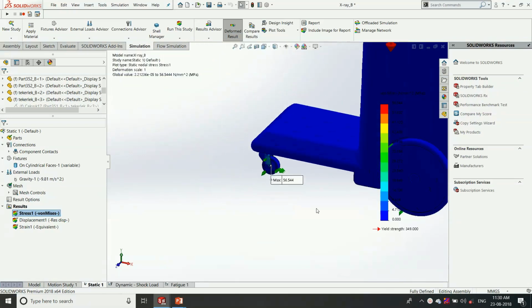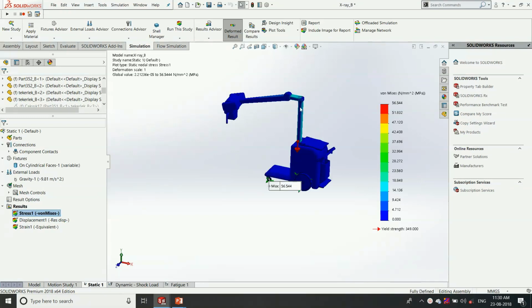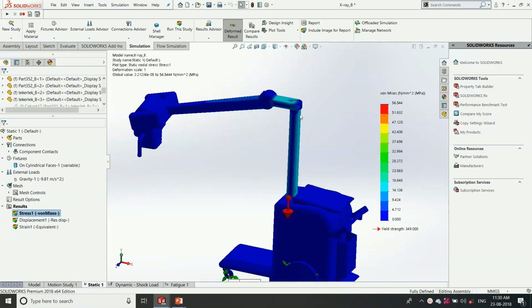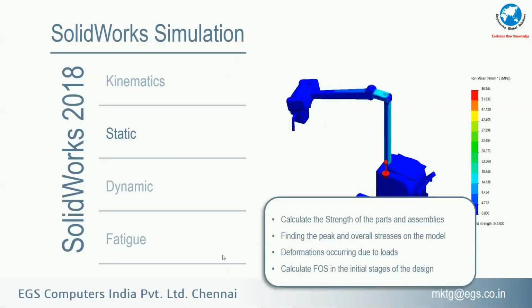So this process will give a clear-cut idea whether the structure will satisfy our condition or not, or how we can modify the component so that it can withstand the load. So in static analysis, we will calculate the strength of the component, and we will calculate what the peak stress concentration in the model is.